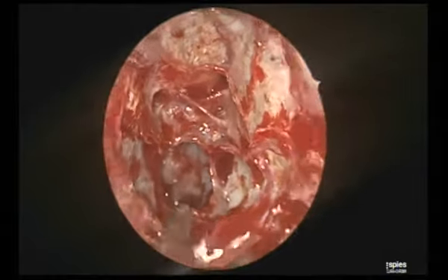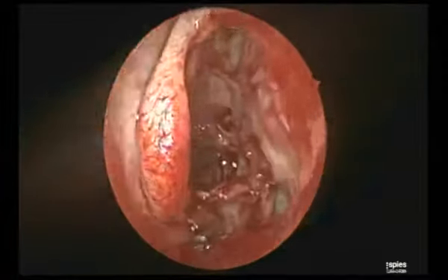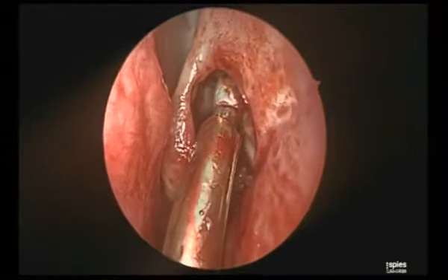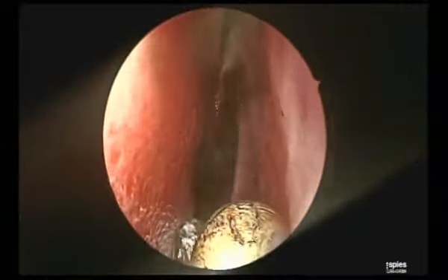Satish, a quick question. Why is your debrider not getting blocked? What is it that you're doing? I told you in the beginning, it is how you use it. Don't press it against the structure. If I press on the structure, it will clog the cutting edges of the debrider and whatever comes in can block. You have to keep the debrider a millimeter away from the area where you want to work. So it cuts and sucks. That's the principle of the micro debrider.